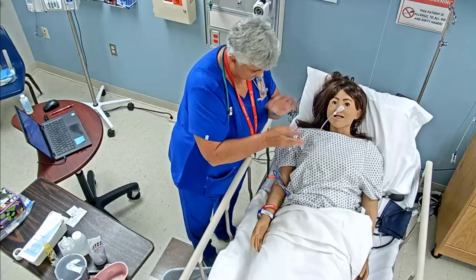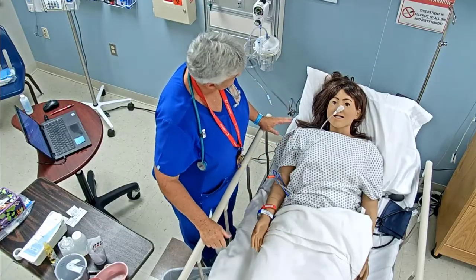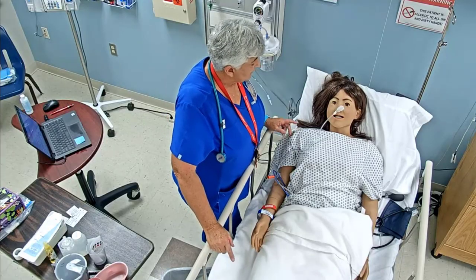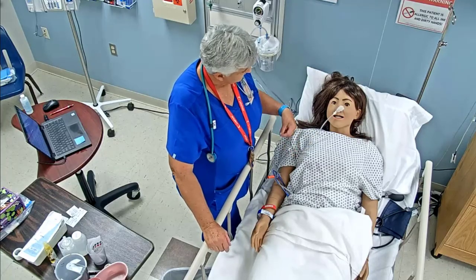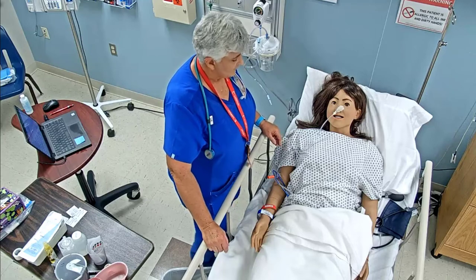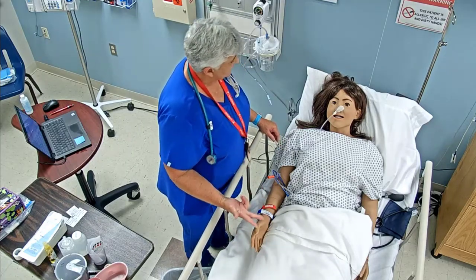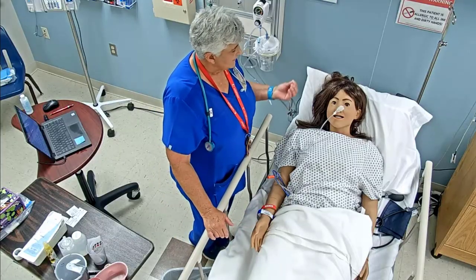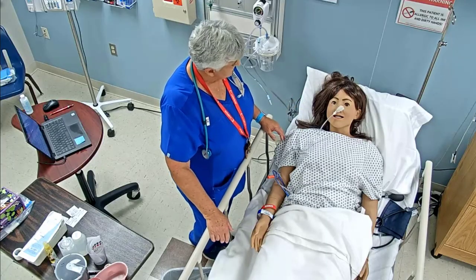So before I start doing that, can you tell me again what's your pain level? On a scale with 0 being no pain, 10 being the most pain, what would you rate it now? Did that help relieve some of that tension on your stomach? So 1, okay, and we would go through our COLDERRA again: characteristics, onset, location, duration, exacerbation, what relieves it, does it radiate, and any associated signs and symptoms.